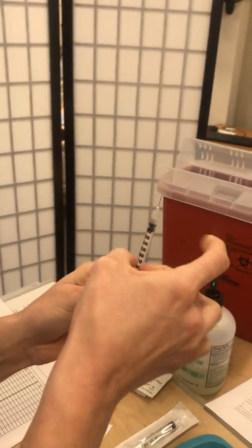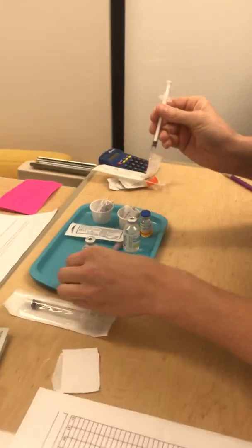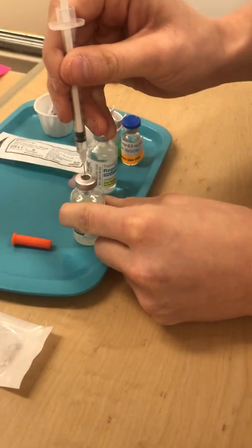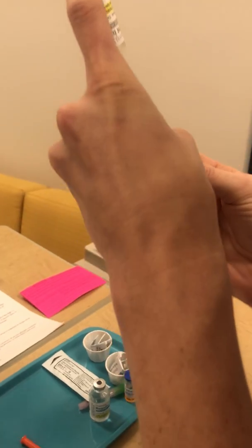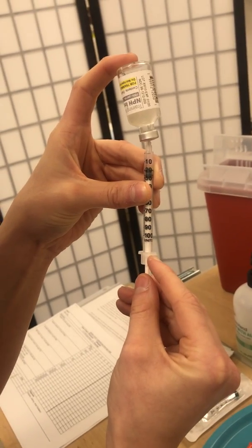Perfect. And then pull straight out. Just don't want any bubbles in there. Perfect. So we have 11 of our regular, and now we're going to get 10 of our other NPH. We already injected the air into this one, and we rolled this previously, so then it'll be a total of 21.